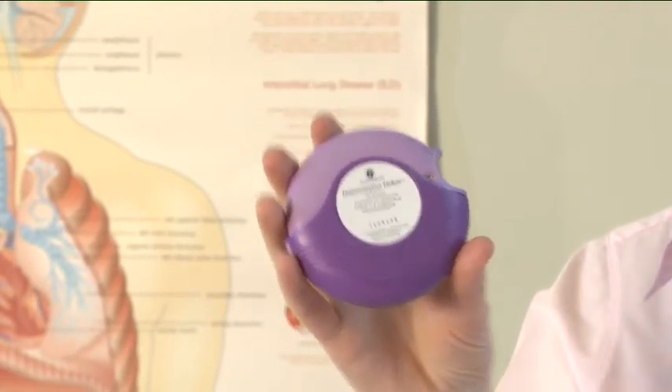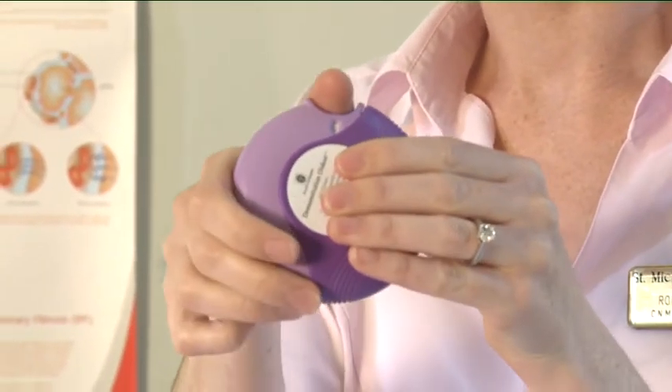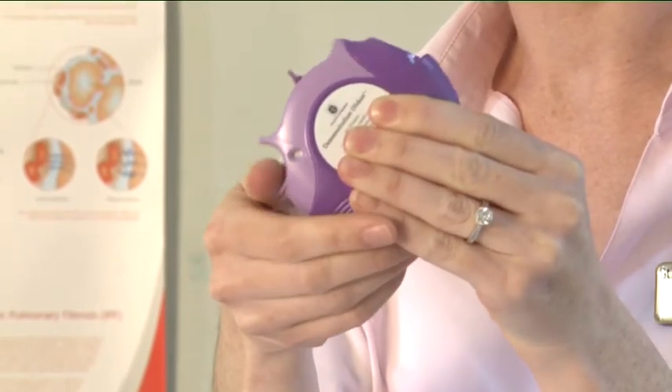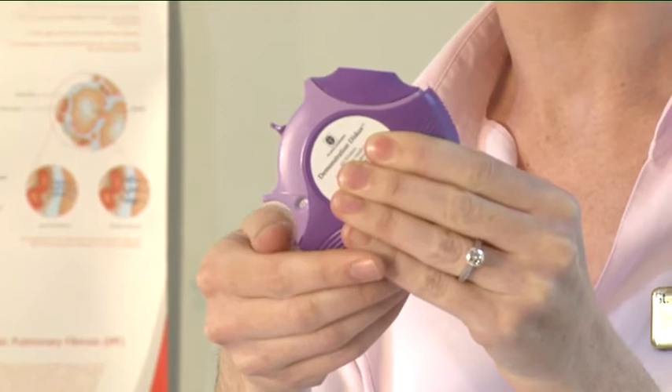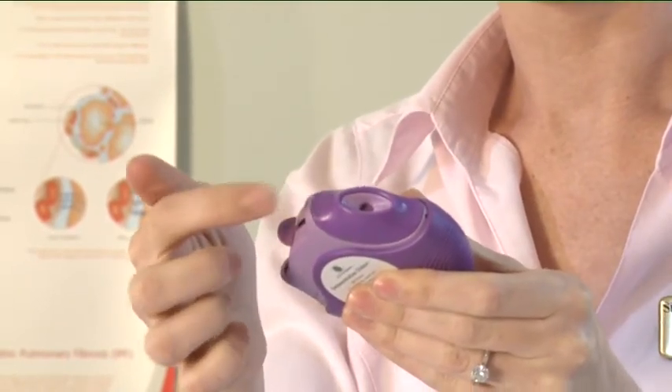Using your inhaler. To open your discus, hold the outer case in one hand and put the thumb of the other hand on the thumb grip. Push your thumb away from you as far as it will go. You will hear a click. This will open a small hole in the mouthpiece.